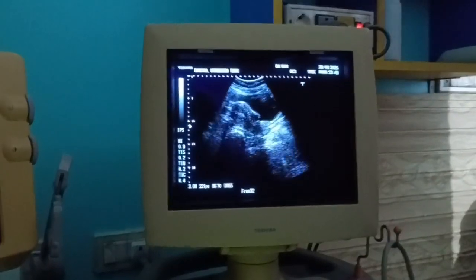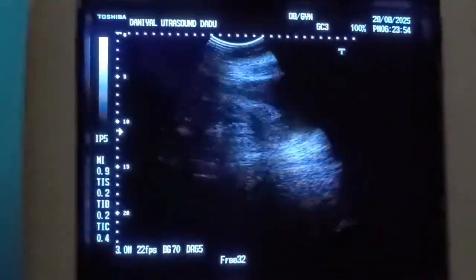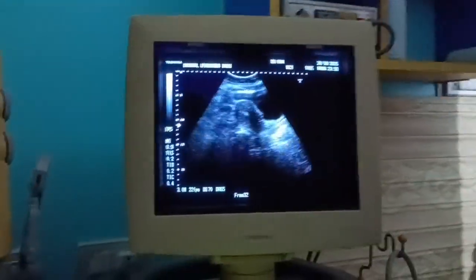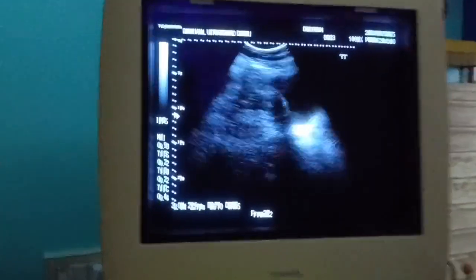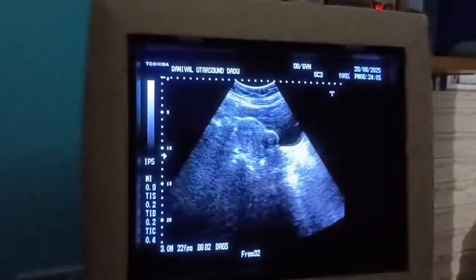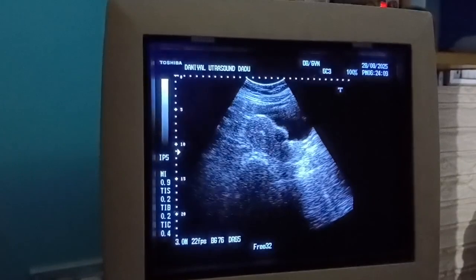Lady patient complaining of bleeding per vagina, BPV. She has a history of infertility with recurrent abortions. Now she came to my clinic for the bleeding per vagina. On ultrasound of pelvis, here we have got special findings I would like to share with you guys.